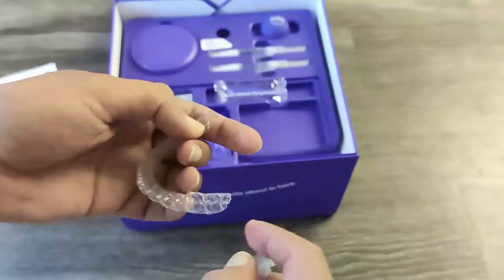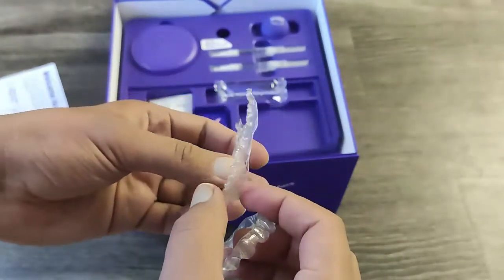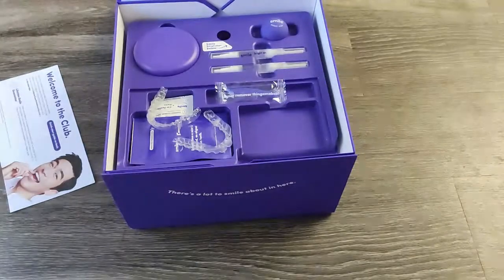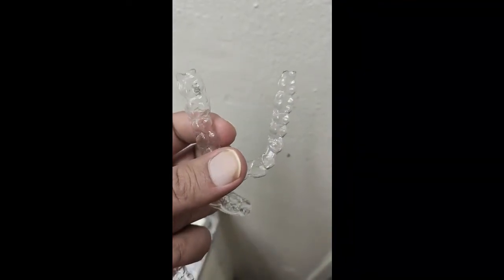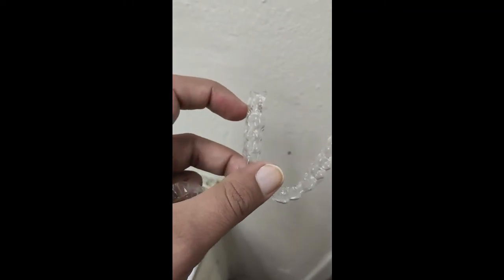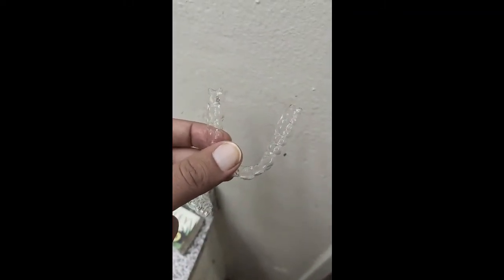This is how the aligners look — they appear kind of faded and milky, not very clear, but once I wash them with water they start looking clean, as I'll show in a coming video. A number is written on both the top jaw and bottom jaw aligners so you don't mix them up and you know exactly which set you're wearing.